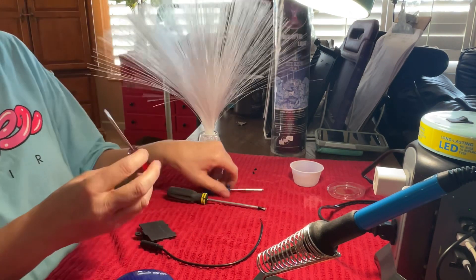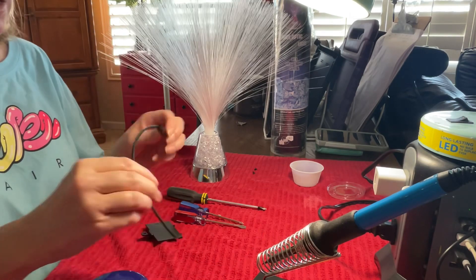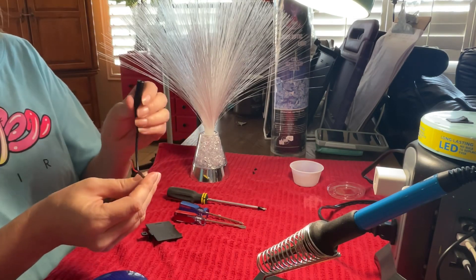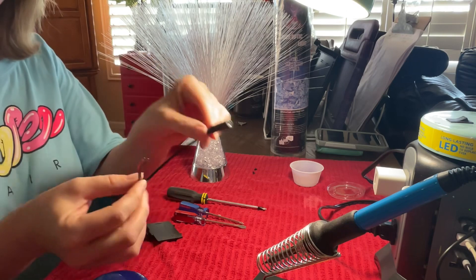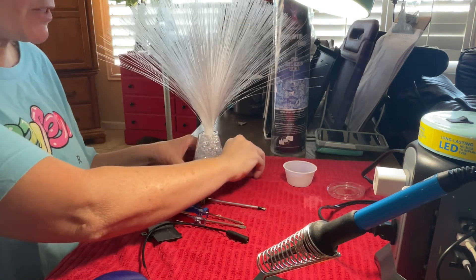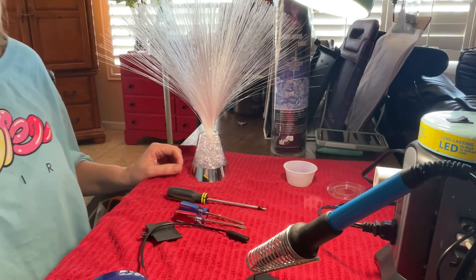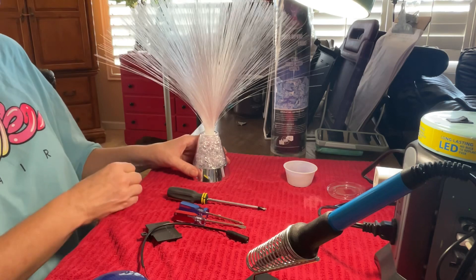Today we're going to need small screwdrivers, a switch to test it, and a female 3.5mm jack. I have a little container to put the screws in because I often misplace them, and then of course a soldering iron to take care of the soldering.